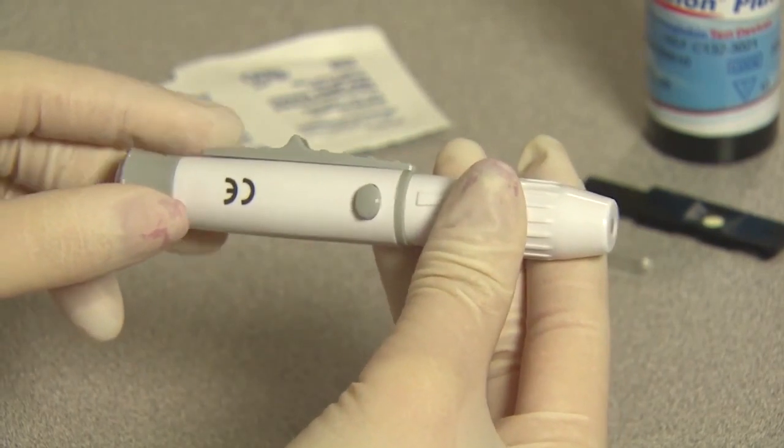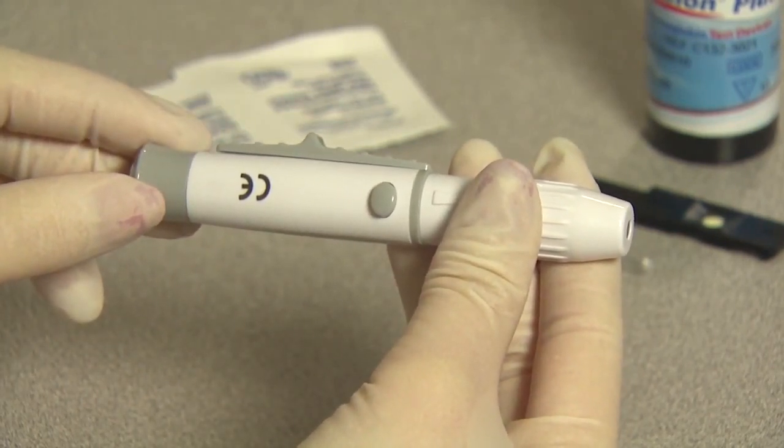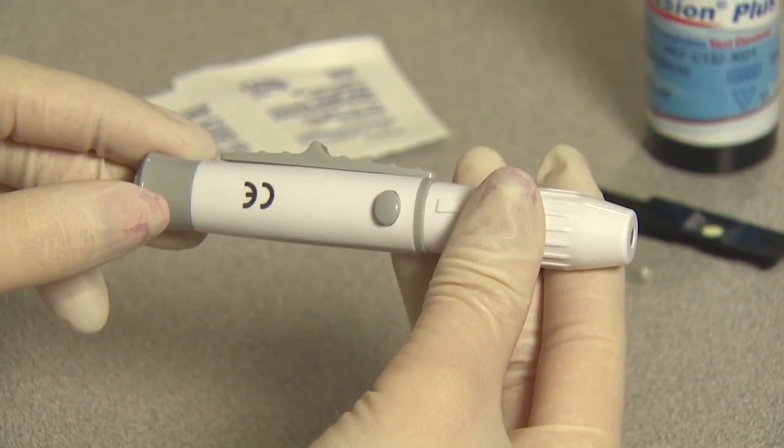A click may be heard. The device is now loaded and ready to obtain a drop of blood.